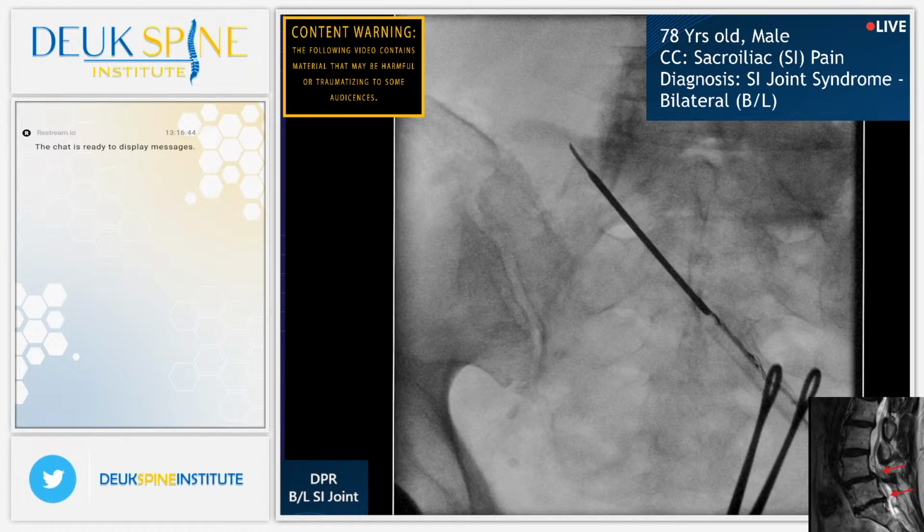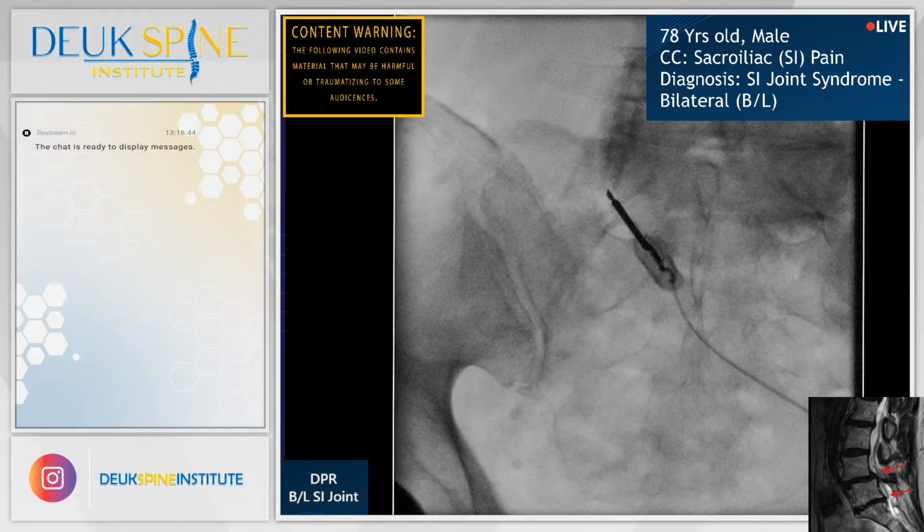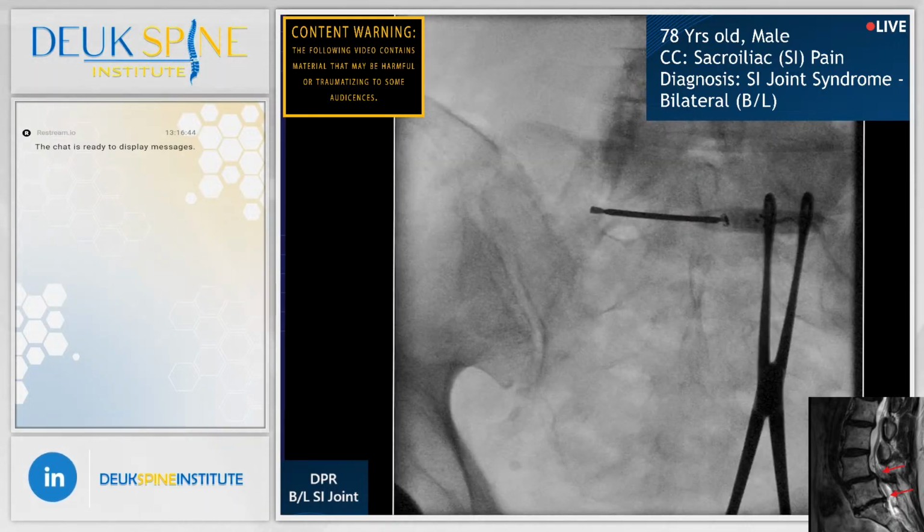That's very nice. Shot. Any questions, Sean? At this moment, no current questions. I think I understand what's happening.